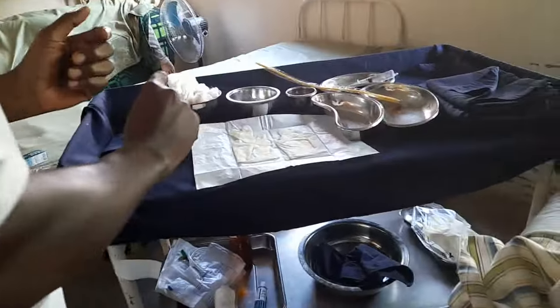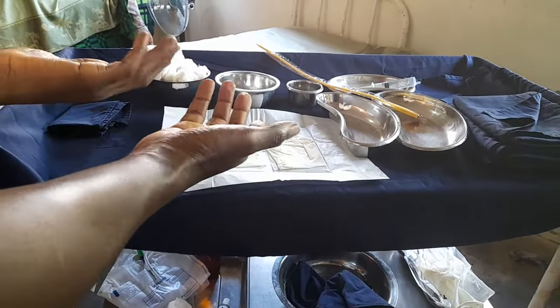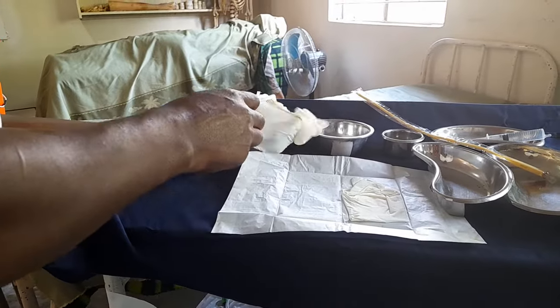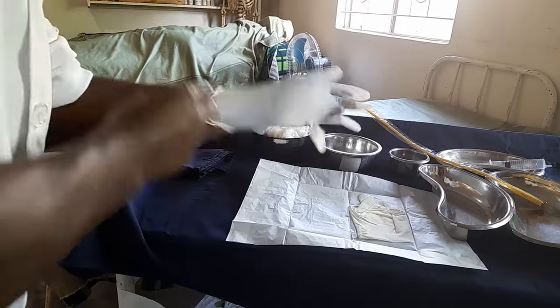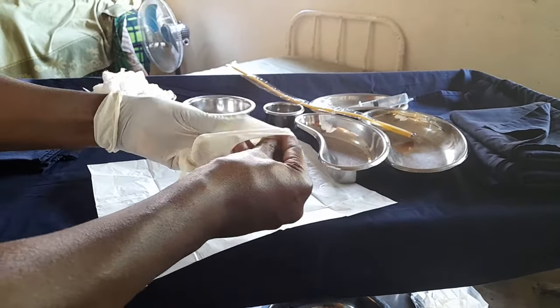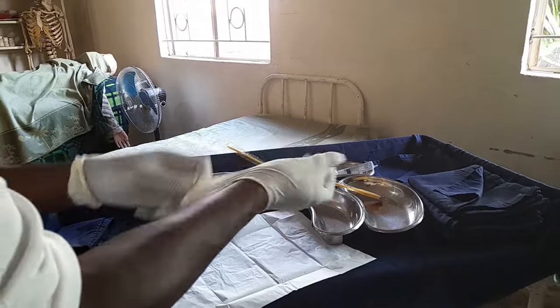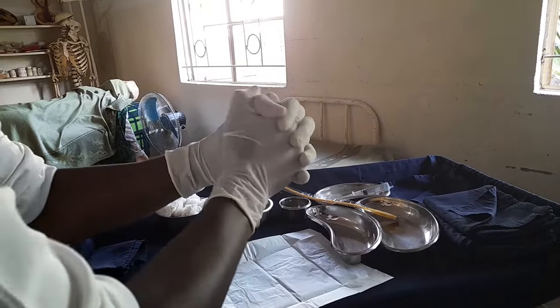Now donning of gloves — this is a sterile technique. The cuff part is clean because you're going to hold it, but the finger part you are not supposed to touch with your bare hands. Pick up the glove, then slide in your fingers. Once one glove is on, you can hold the inside of the other cuff — that side is now sterile — and put your fingers in. Finish off by aligning the fingers where they're supposed to be. Since the outer surface is sterile, gloved hands can touch each other.